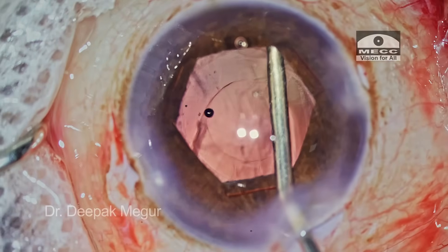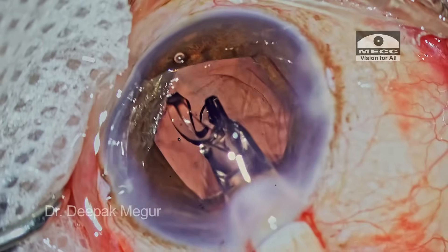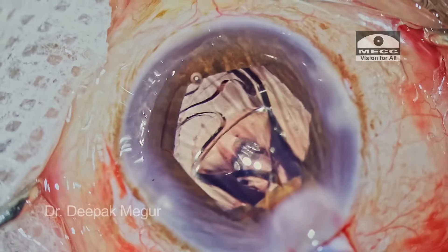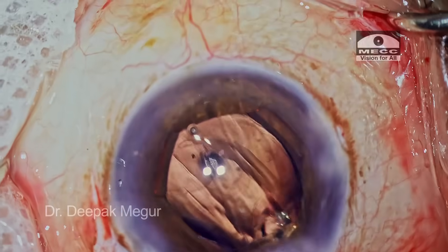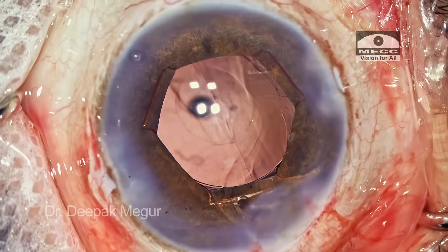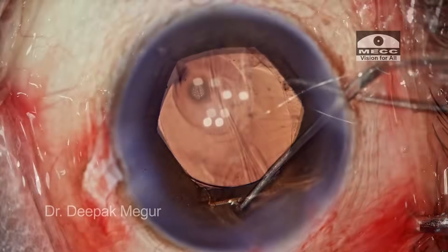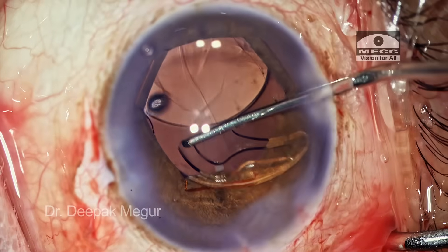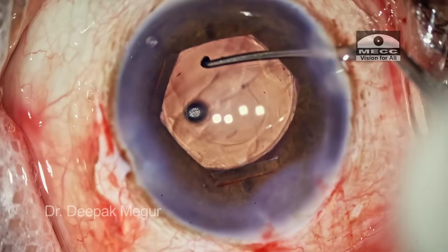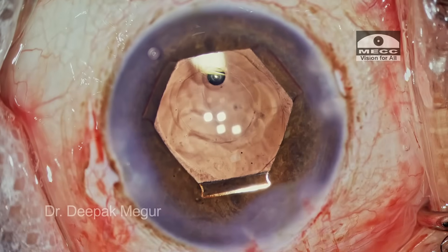The one disadvantage of hydrophilic lenses is they are a little more bulky than aspheric hydrophobic lenses. Nevertheless, the space is created within the bag by injecting OVD. I ensure the leading haptic goes into the bag in the first shot — and it does. As the lens is being implanted, I keep a close eye on the posterior capsule tear, watching whether it will extend, because even during IOL implantation the posterior capsule tear can enlarge. At this stage it looks fine. I use the dialer to dial the trailing haptic into the bag. Once both haptics are in the bag, the posterior capsule tear is still in a circular fashion — it has not enlarged, which was a relief.